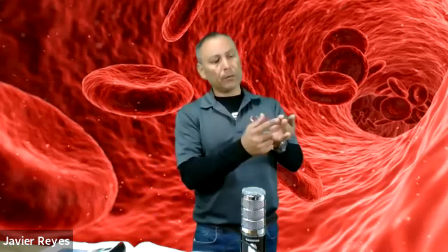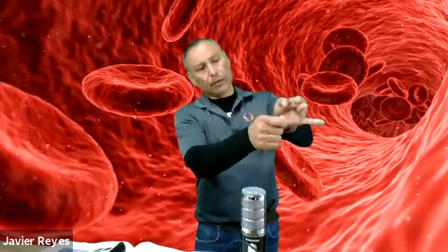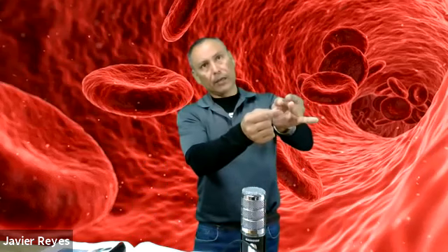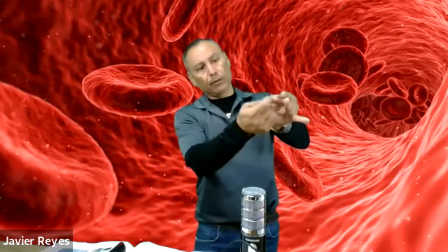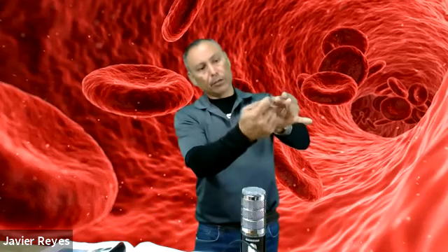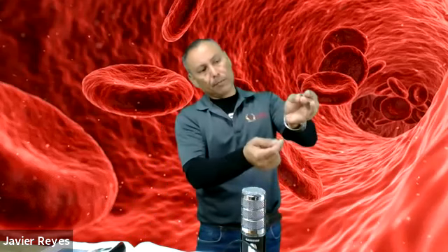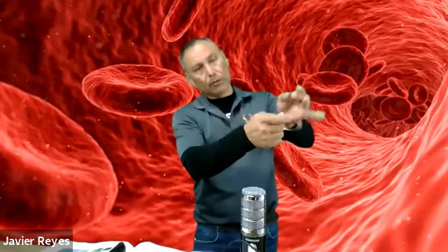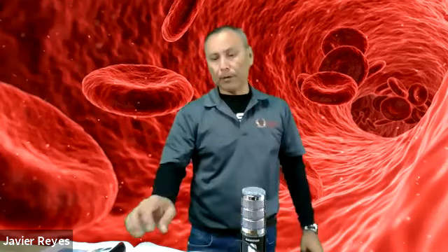So, recommended site and direction of the finger puncture. Again, for the hand, you want to puncture on the meaty part, but more so on the side. This will help you collect your specimen. As you're collecting this way, the blood drops. Make sure you do not make any contact with the skin. Make sure you do not scoop. You do not perform any scooping motion. Just let the drop, press and release. Press and release, and the blood will come into the tube by itself by capillary action.